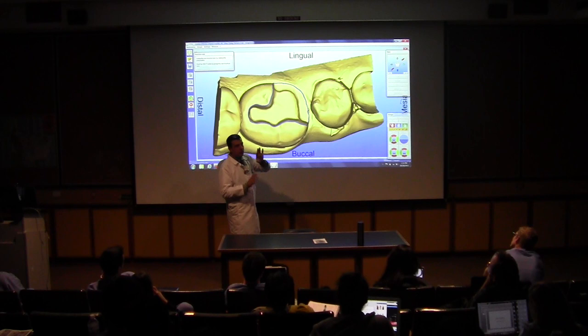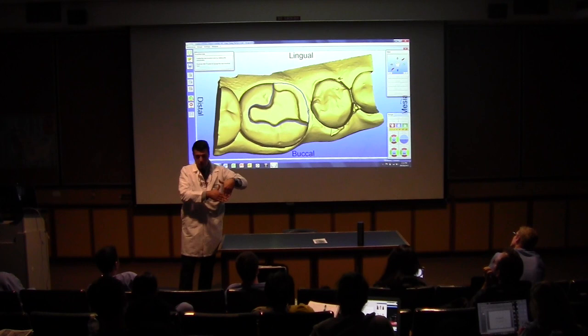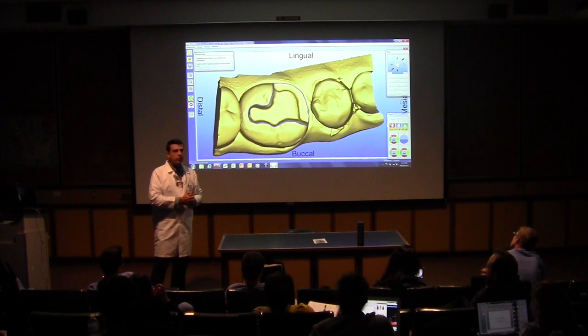I'm just giving a warning, but if you want to keep going, it's up to you. Go back to the patient's mouth, reprep that particular spot, that particular area using a finishing diamond, and then you scan the prep again, making sure you no longer have the undercut.